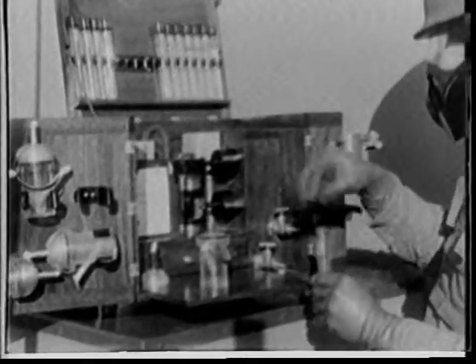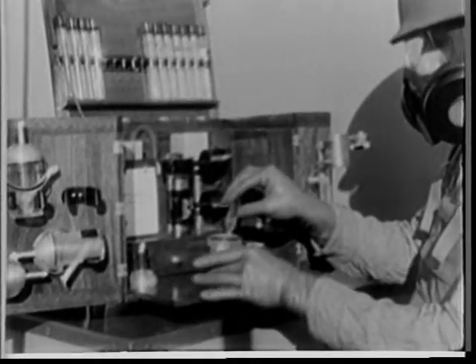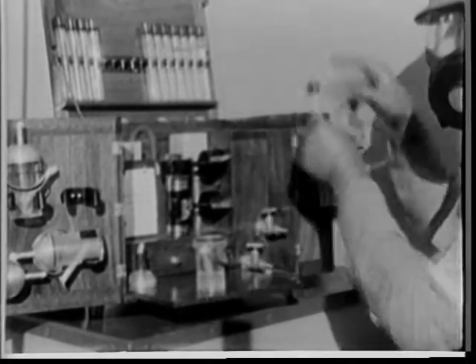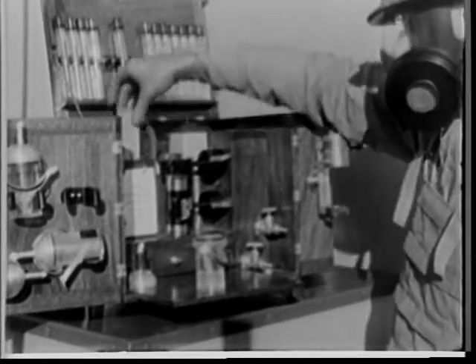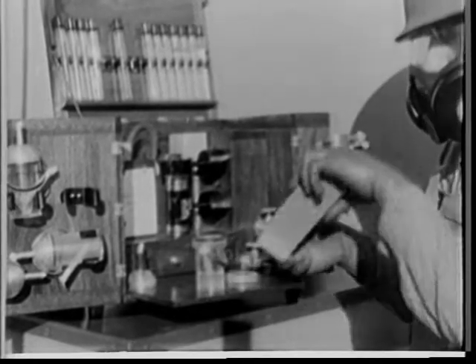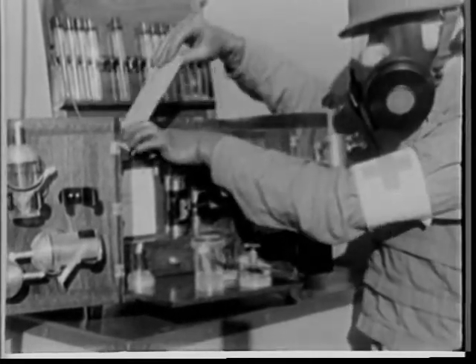To collect a sample, the operator first puts liquid in an impinger. Next, he prepares two molecular filters — one for the impinger and one to be left exposed to catch any BW agents which might fall on it.